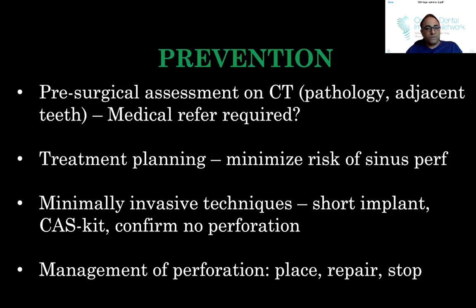Using minimally invasive techniques, right? So the cast kit, short implants, and then managing the perforation. If there is a perforation, manage it. Again, not being aware of it can lead to bigger problems, i.e. sinusitis.